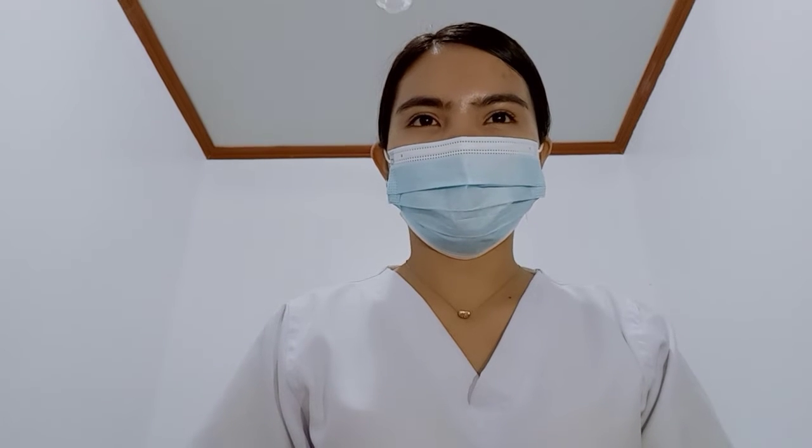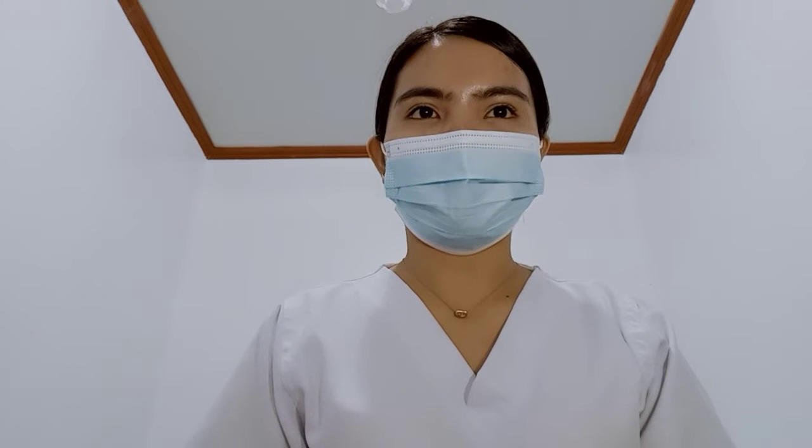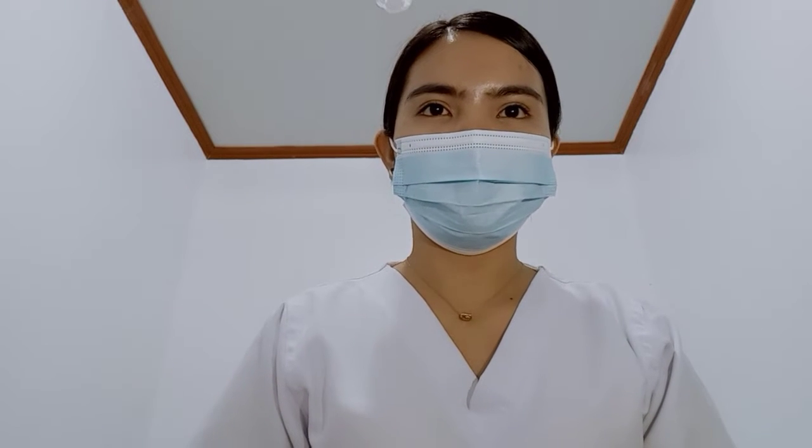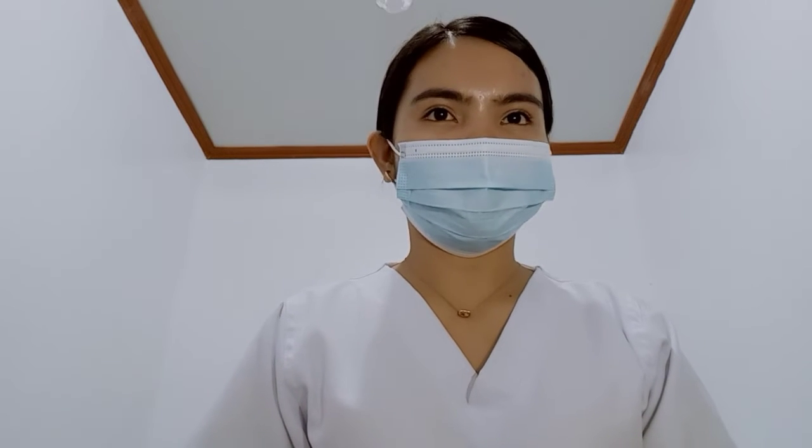Measure temperature first, followed by pulse, respirations, blood pressure, and oxygen saturation. The purpose of this is to assess the client's condition, to determine the baseline values for future comparisons, and to detect changes and abnormalities in the condition of the heart. So we need to take the vital signs.